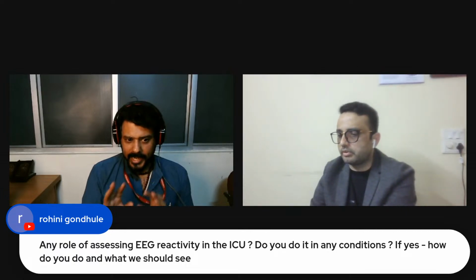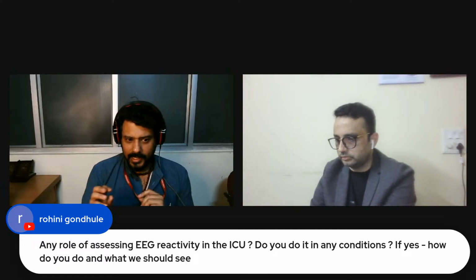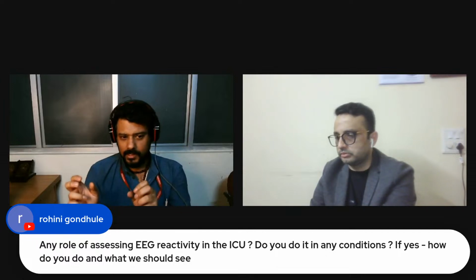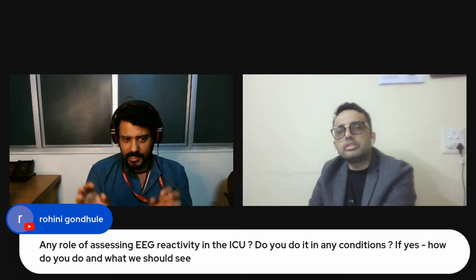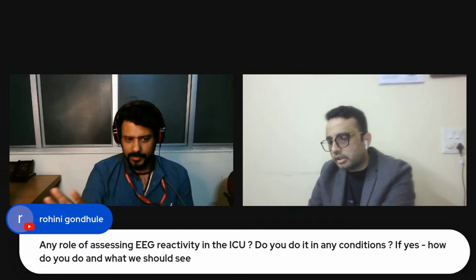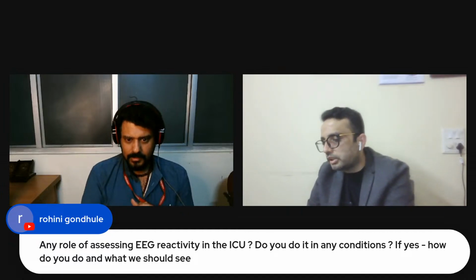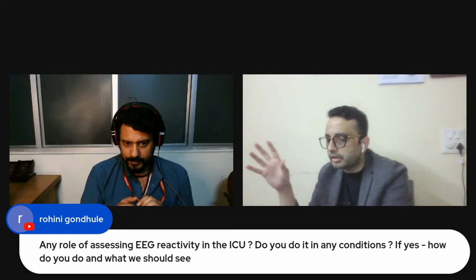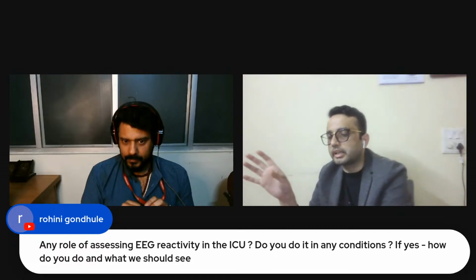Okay. So for reactivity, are there any specific guidelines that this much increase in amplitude or increase in the frequency of the faster activity should happen? Or do you just have to appreciate it visually? Yes, sir. In that ACNS paper which I was talking about, they have clearly mentioned that whenever we are checking reactivity, we check for change in amplitude and frequency both. So it could be either an increase in the amplitude or an increase in the frequency. Merely the presence of myogenic artifact won't qualify, because myogenic is extracerebral activity. But if there is a change in the amplitude or frequency, that means there is reactivity.